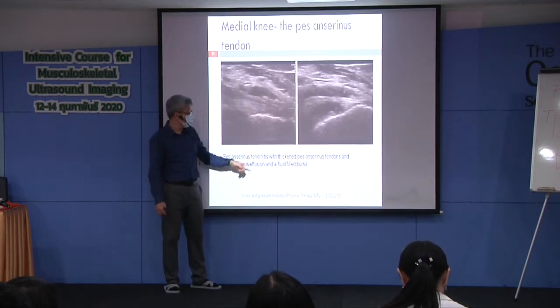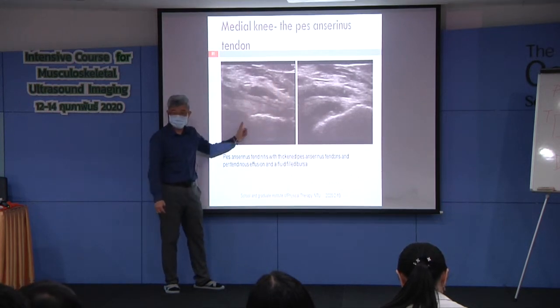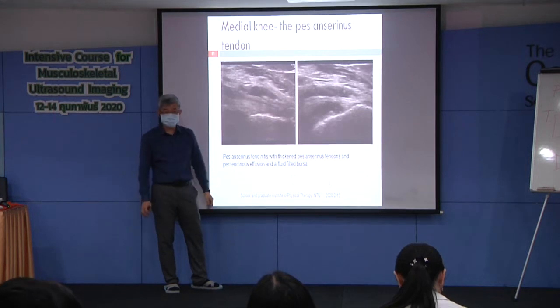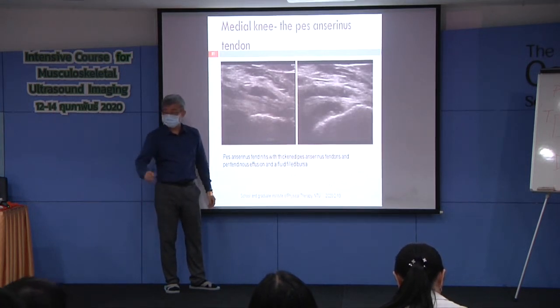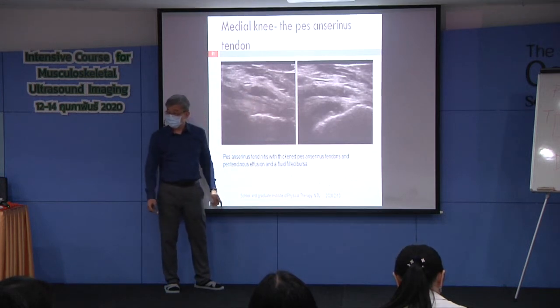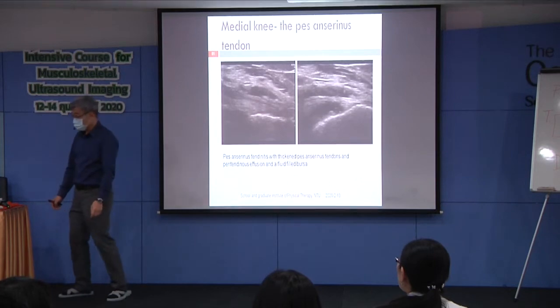He says no, and you say, okay, talk to me later when you get another picture with color mode. You talk very professionally, and remind him, do not use color, use power mode, and he will be terrified by what you learned today.